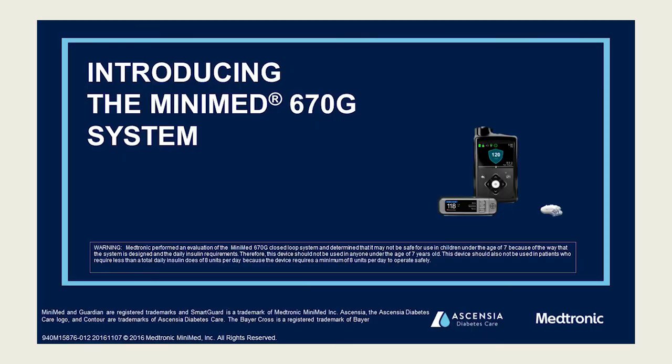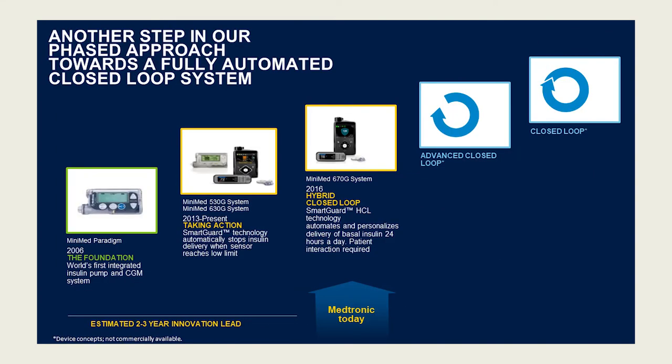Now the FDA put a lot of safety requirements, and so if at all the system feels uncomfortable, then it will kick you out and you will go back to normal pump functioning. But this was certainly a big advancement. Again, it started with the pump's ability to stop the insulin flow for up to 2 hours, if it predicted, or at that time, if the blood sugar was low. So in case somebody didn't wake up, it didn't continue insulin delivery.